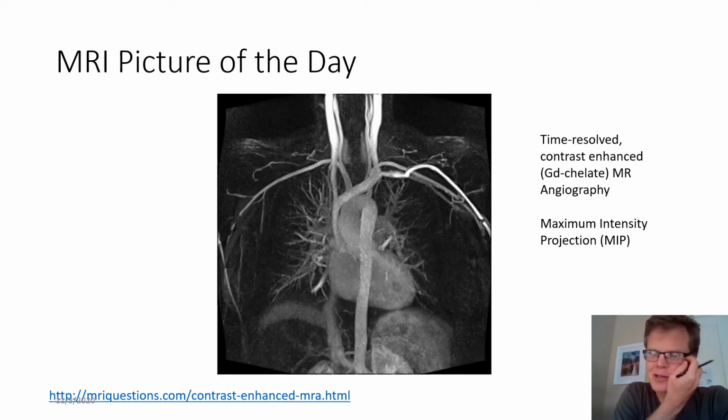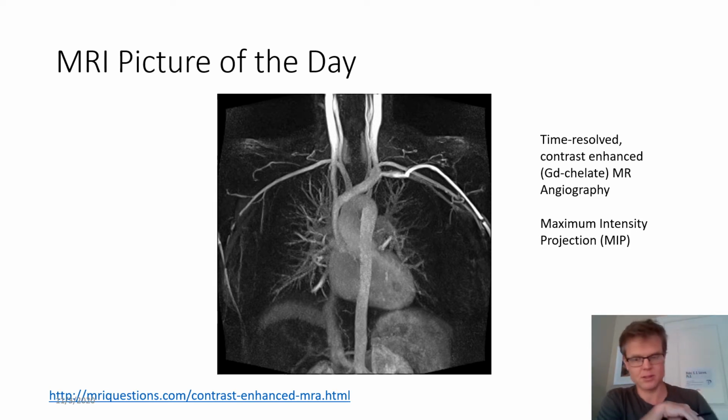First, our MRI picture of the day distraction here. This is a contrast enhanced scan, MR angiography. What this means is the subject had a gadolinium chelate injected intravenously, and this agent primarily, at least at first, shows up in the blood vessels.